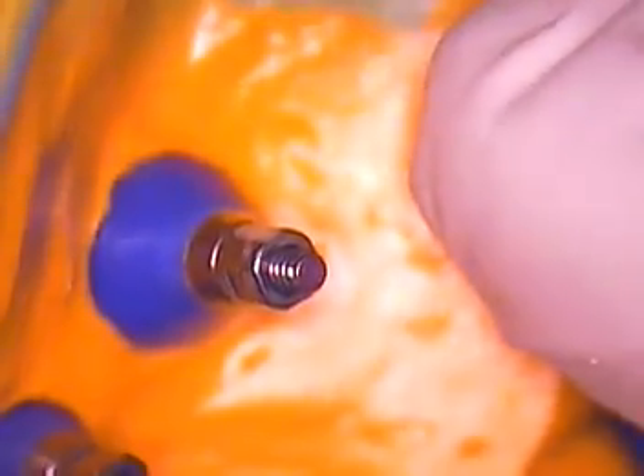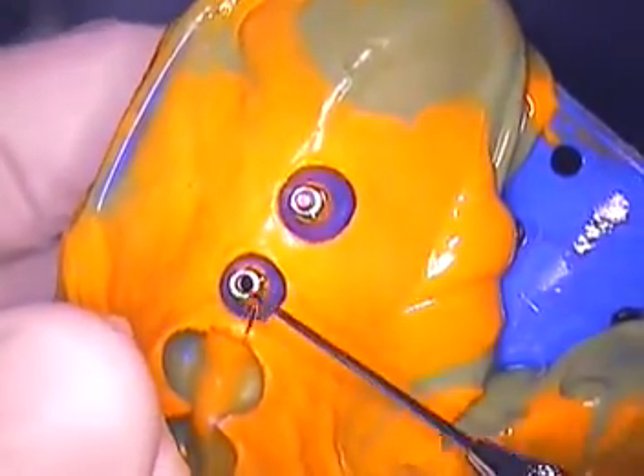What I do routinely is, in the mouth on the impression, I'll take them out completely so they'll look like this, and this part will be in my hand, leaving that impression coping where it is. Then you pull it, and now you have less chance of getting caught by this screw. That can easily be a thread or two, and that's all it takes — especially when you're trying to get past an undercut on this tooth or this tooth here with a withdrawal path, doing combination cases, or you've got real long preps or real long teeth from crown and bridge, and you end up with a problem because of path of insertion.